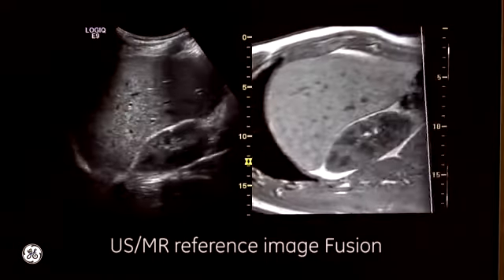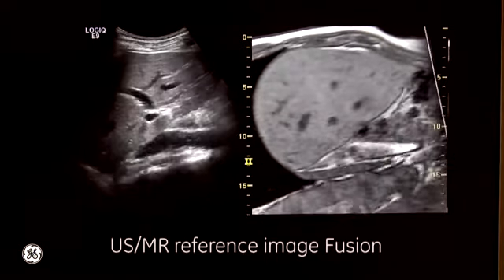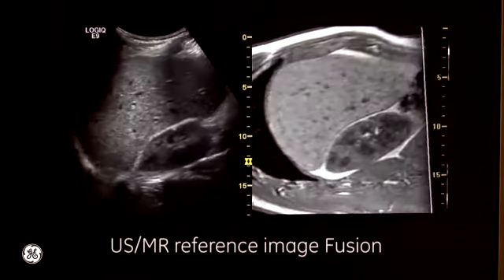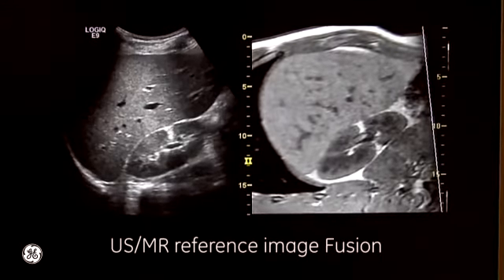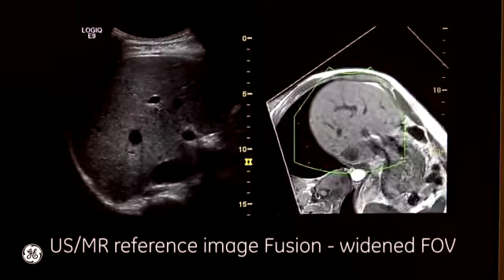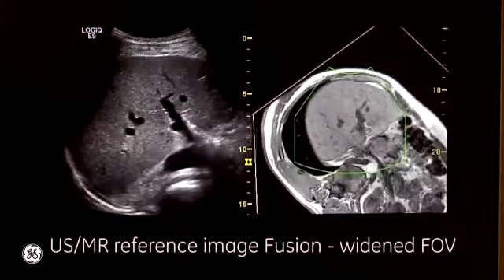The first image represents an MR that's been brought onto the ultrasound system, fused with our real-time ultrasound. As you can see here, they're both in the same orientation as well as the same scale factor, so they're synced together. We also have the opportunity to now widen the field of view of the MR so we can see the full anatomical structure as well as the orientation of where the ultrasound probe is on the anatomy as seen by the green graphic.